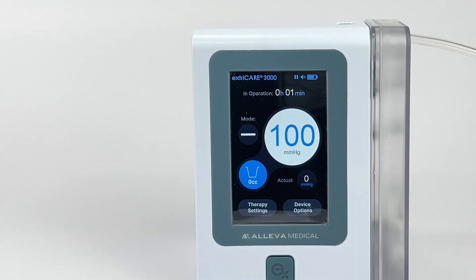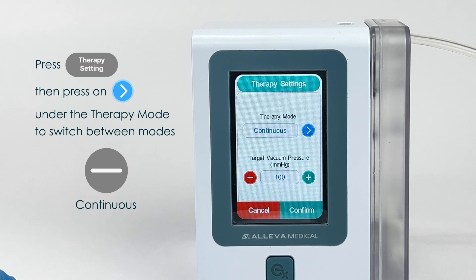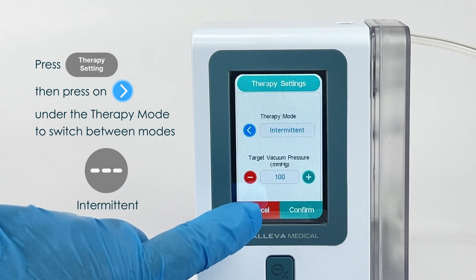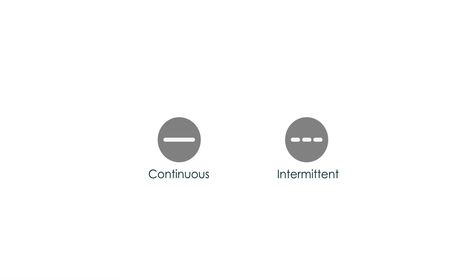To toggle between these two modes, make sure your settings are not locked. Press down on the Therapy Settings button located at the bottom left of the screen. A Therapy Settings page will appear. Under the Therapy Mode option, press the blue arrow button to switch mode, then press Confirm. On the main page, you can tell which mode the unit is running by looking at the line under the word Mode. A straight line means the pump is in continuous mode; a dashed line means the pump is in intermittent mode.